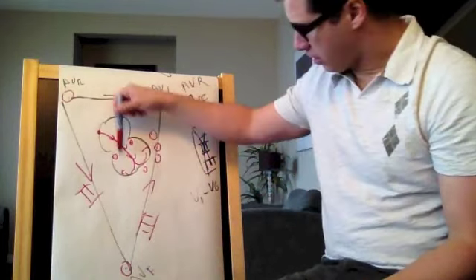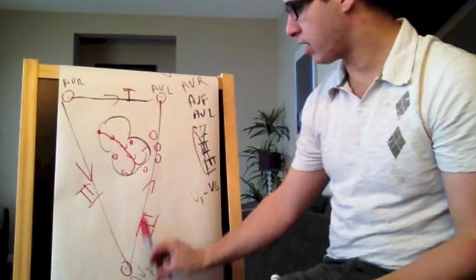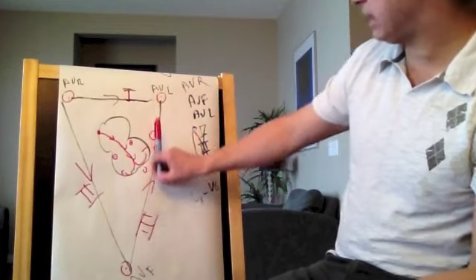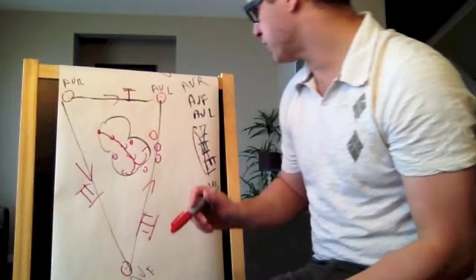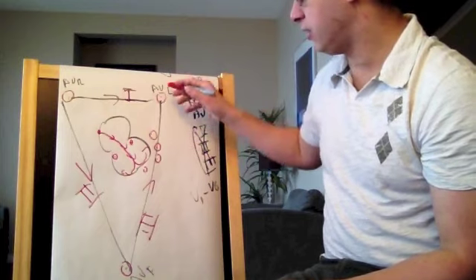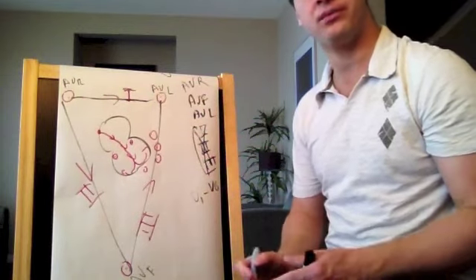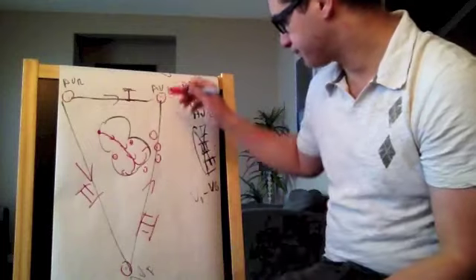AVF, a part of it will be positive, but a part will also be negative, because as you can see, electricity will come kind of towards it a little bit, but then after that will go up as it gets into the left branch. In AVL, it's a little bit the same kind of thing. The electricity mostly goes this way because it goes there. So AVL can be a little bit different as well.